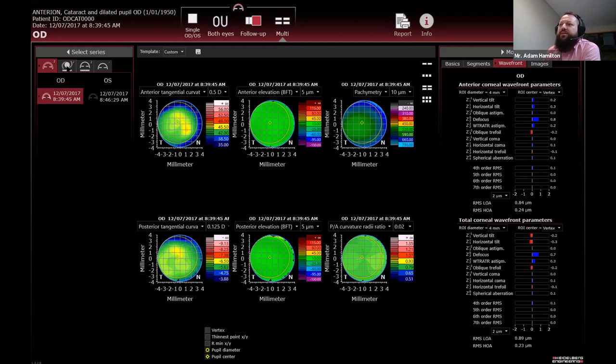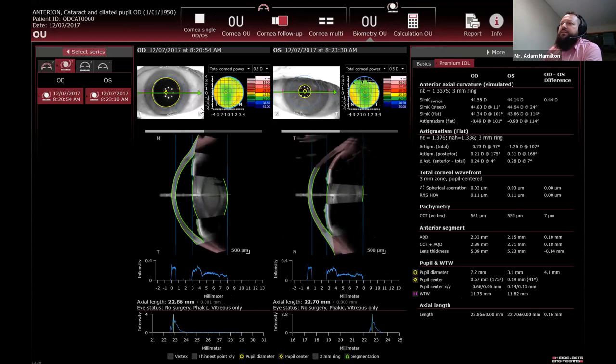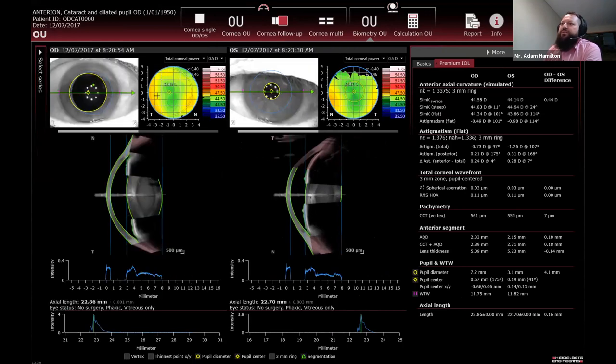Looking over at the cataract scans now. Again, as was pointed out, even without the topography module, if you've just got the cataract module starting out, you get a lovely pachymetry and a topography map, so that you can see exactly what is happening with the cornea in a lot more detail than you can with other systems. So you can see if it's a bow tie astigmatism, if the patient's got a suspect cone, without even having to go in and do a topography.